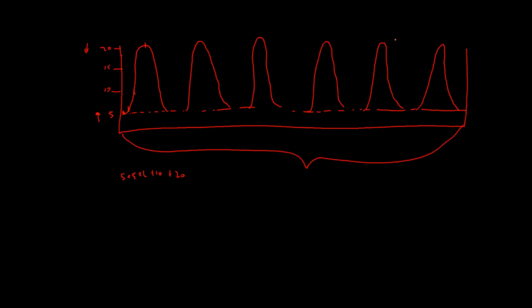Okay, so let's say our mean airway pressure is right here. And we do it as PAW for pressure airway. And this is what it is. So let's say it's at 12. Okay, that is what mean airway pressure is. It's just what is your average pressure for that entire minute.